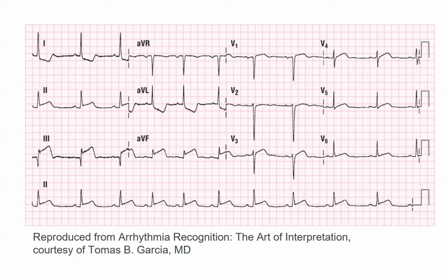You can't quit there. Some people will grab that and then just be like, look, I'm not trying to question. Why can't we quit there? I want to make sure I'm not messing up. I want to make sure I'm not missing a STEMI mimic, really, is the number one reason. So I've got to look across the board. I'm going to look at V2, V3.